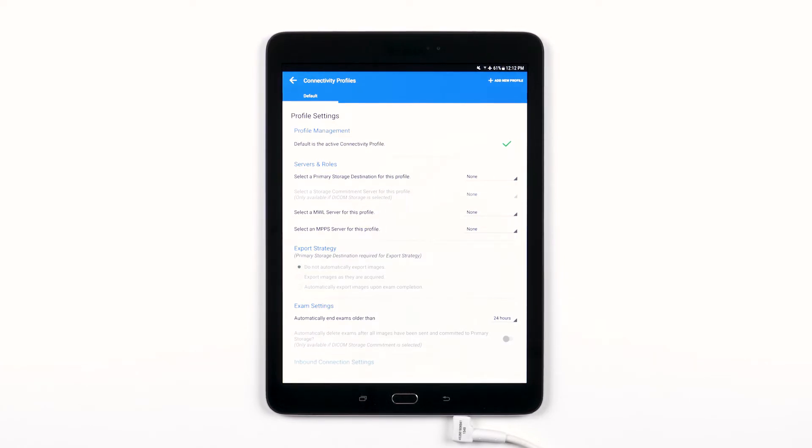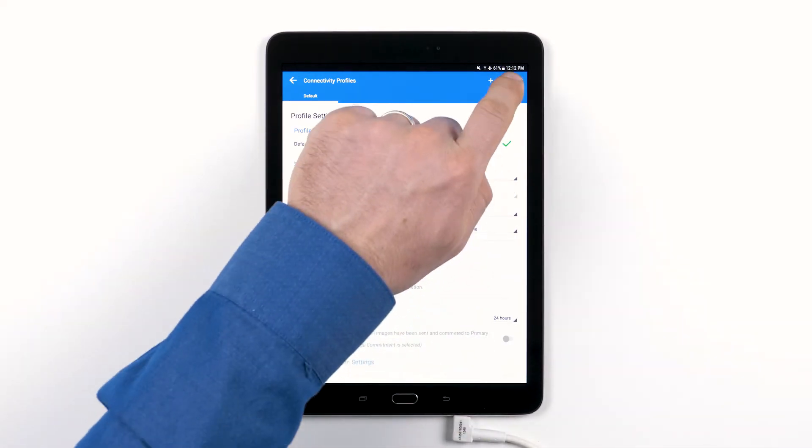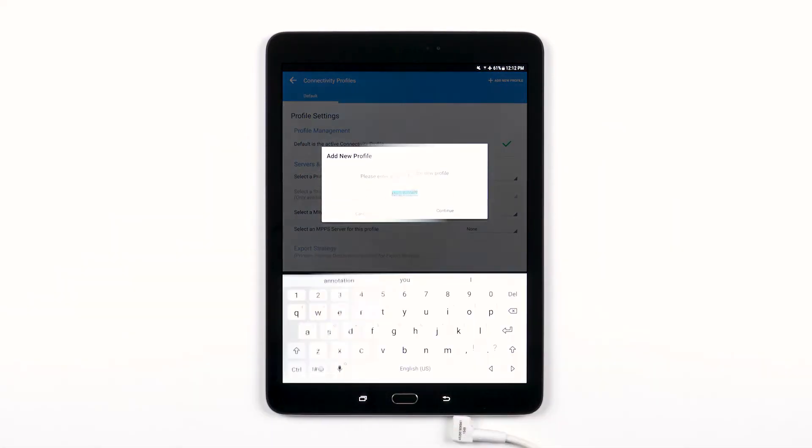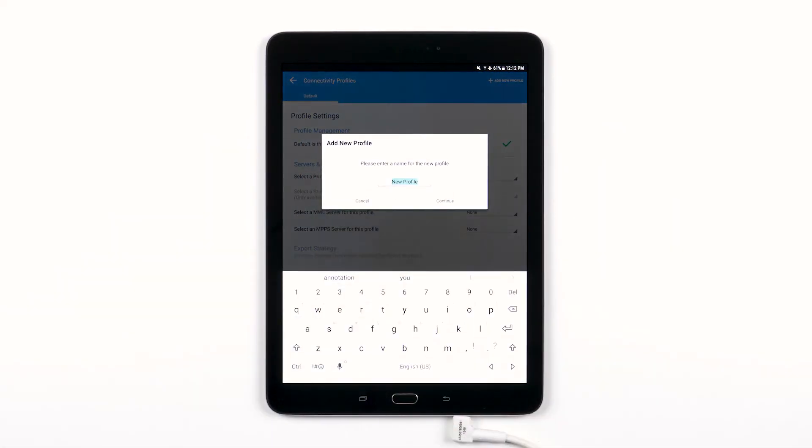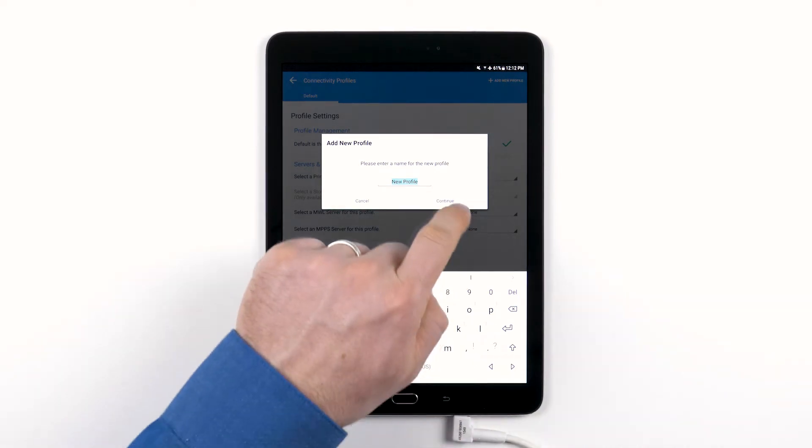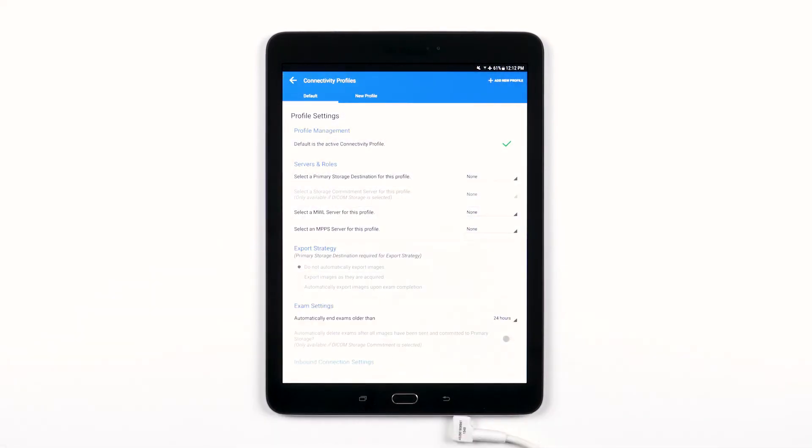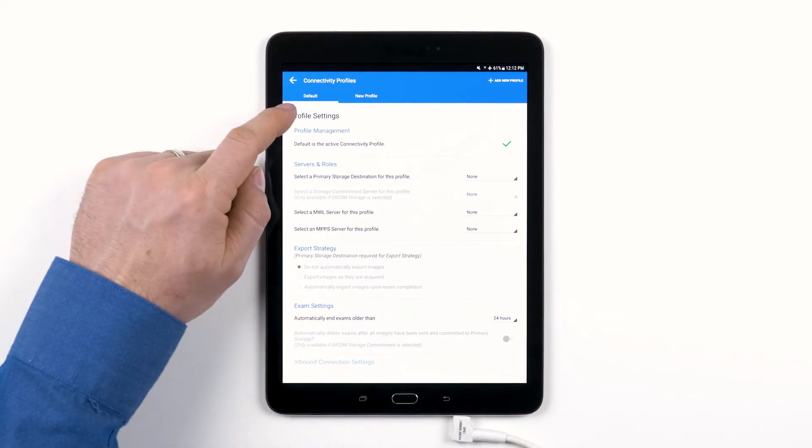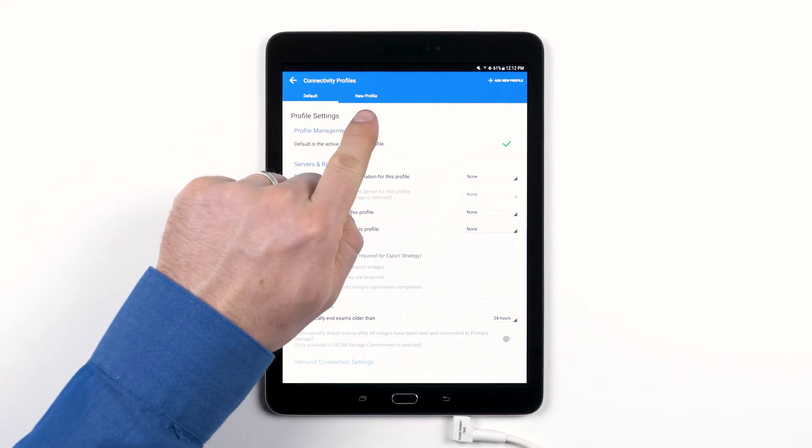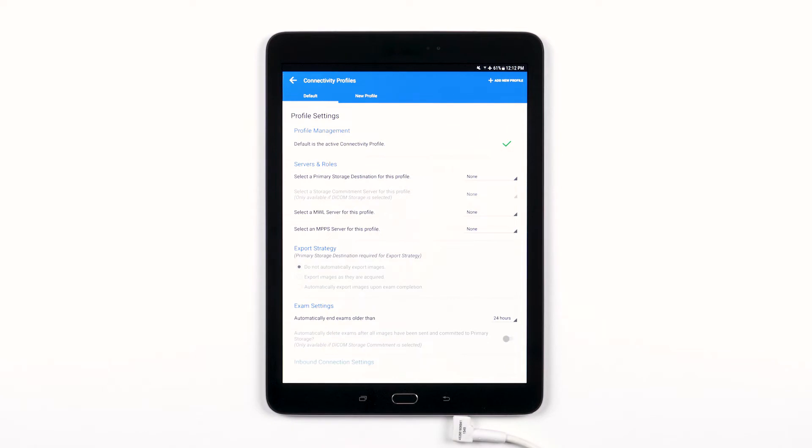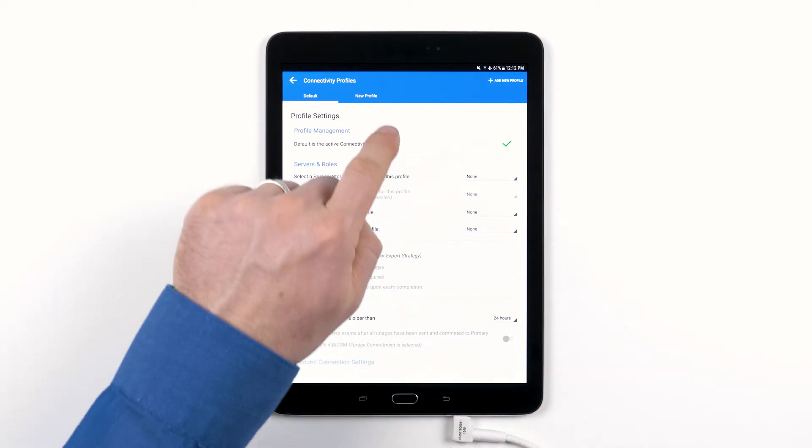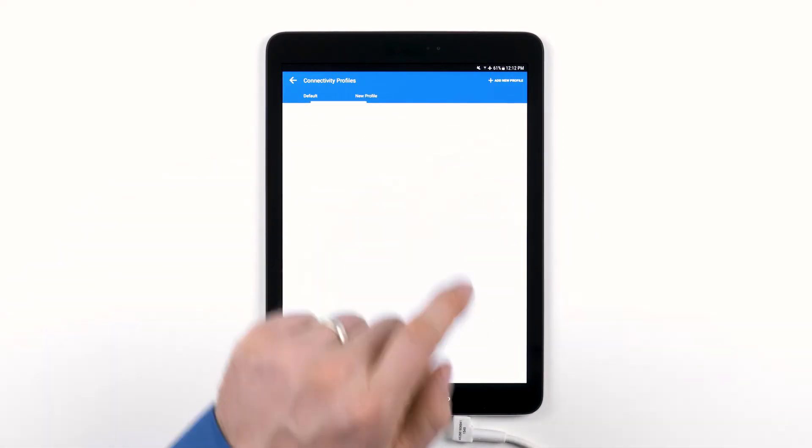Let's add a new profile. Tap the plus icon in the top right, and we'll just name it New Profile. Tap Continue. Now in the Connectivity Profile menu, you'll see that different connectivity profiles are listed on the top of the page in the form of tabs. To adjust the settings in your new profile, tap the name of your new profile.